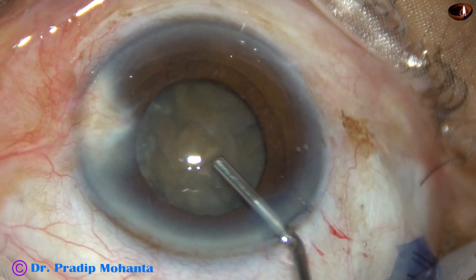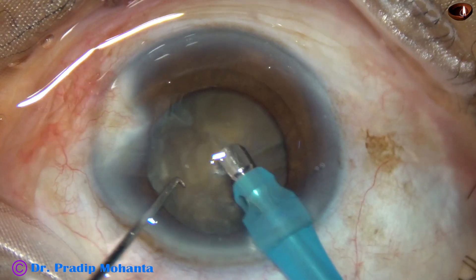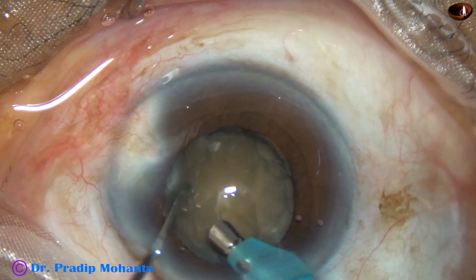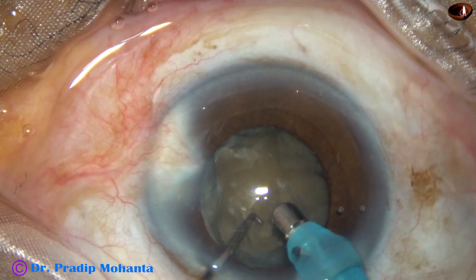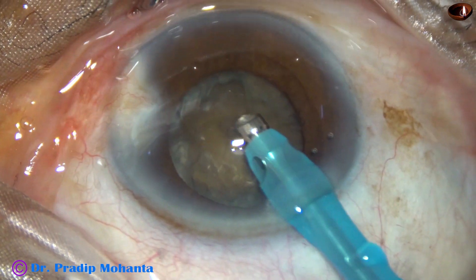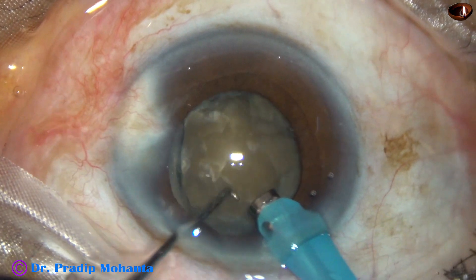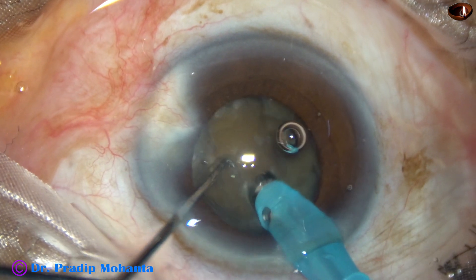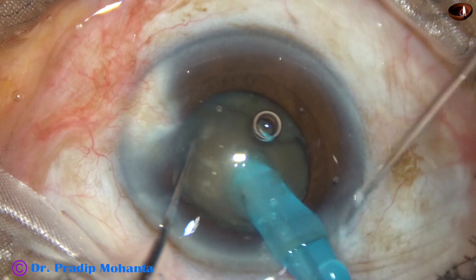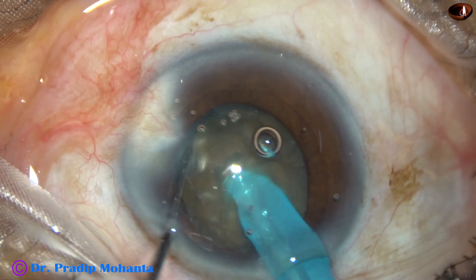The tip of the phaco handpiece is introduced into the anterior chamber. Some superficial cortical matter is removed, then the handpiece is turned with the bevel up towards the corneal endothelium. Now I am going to demonstrate my technique — submarine chop. The tip is buried into the substance of the nucleus. The chopper supports the anterior surface of the nucleus. The tip goes through the substance towards the opposite equator, and now it is chopped.